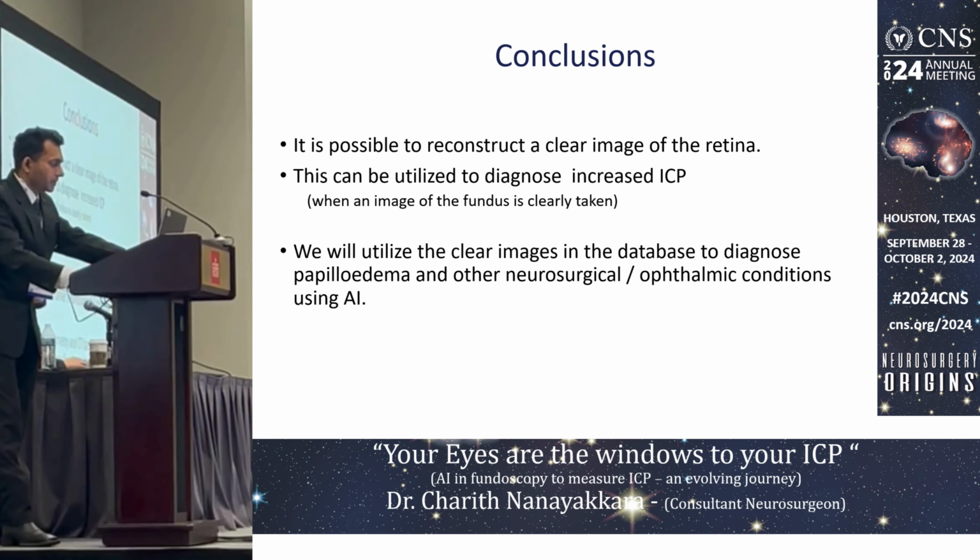We will utilize these images in later ways to diagnose papilledema and other neurosurgical and ophthalmic conditions using AI. We will add pupillometry and CT-based variables in this AI algorithm to further fine-tune the diagnostic accuracy. So these are the conclusions, and this is the way forward.